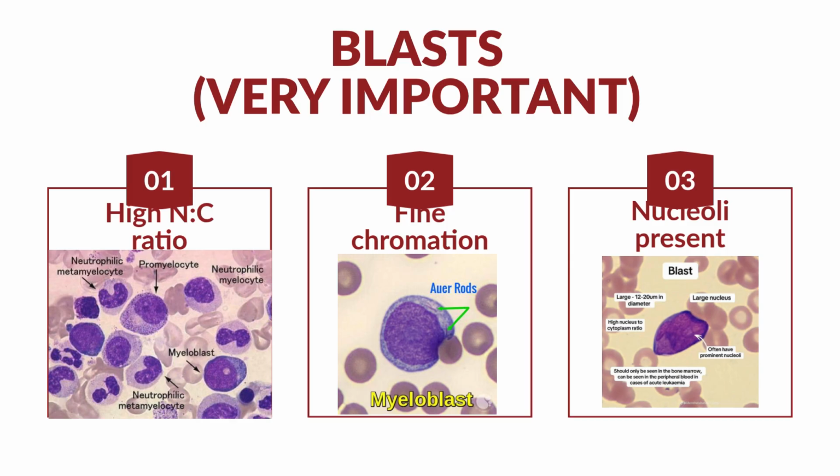If you see number 1 over here, you have roughly 3 cells that are normal. You got 2 cells here and 1 little lymphocyte all the way to the far right corner. But do you see that big old myeloblast? You can't miss that cyclops. You see that big eyeball right there. Then they got that promyelocyte right there.